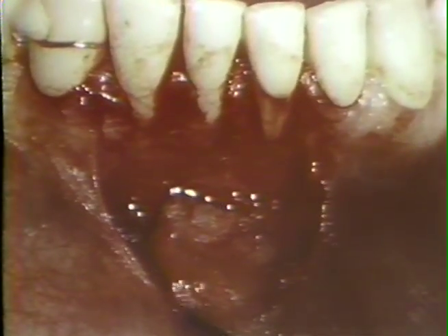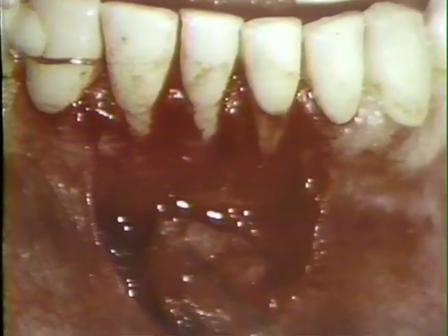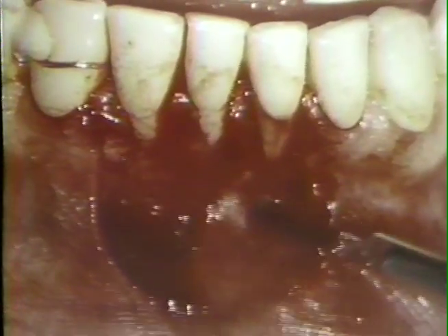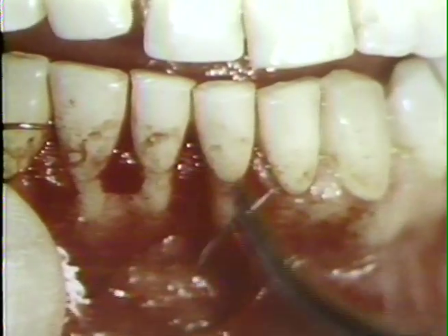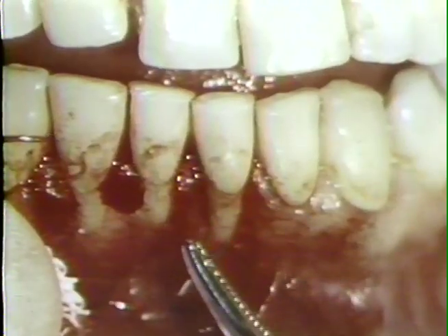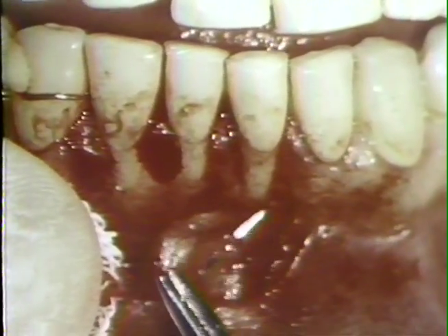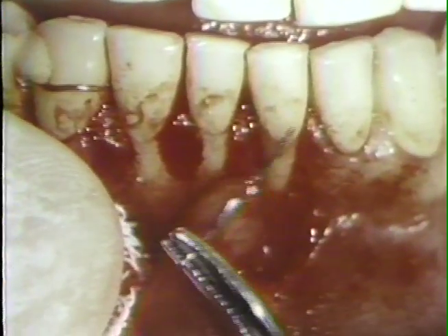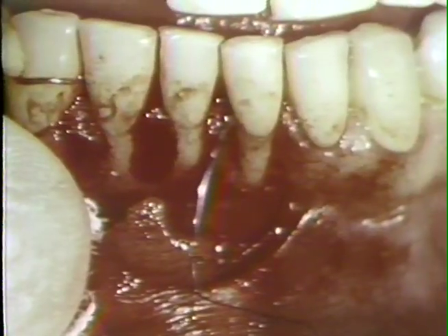A slight cutback incision is made in the mucosa to relieve any tension that exists on the flap. A 6/0 black silk suture with a reverse beveled atraumatic needle is placed through the corner of the flap that will be secured to the distal surface of the cleft. The flap is secured at this position.